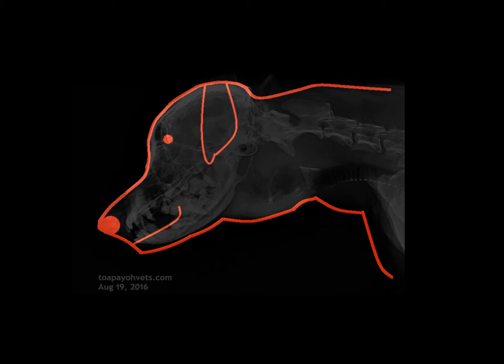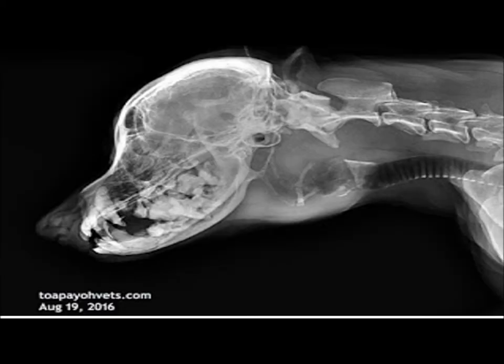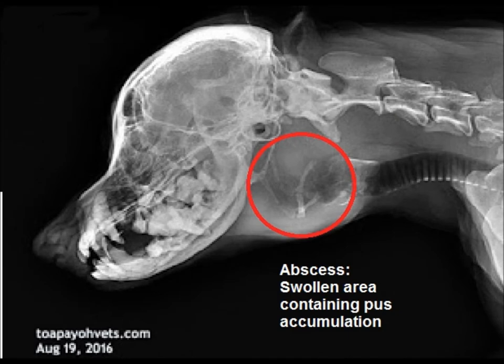An X-ray was taken of the mini schnauzer, and it shows us that the esophagus, barely visible, is constricted, and this could explain its inability to eat, while the trachea has also been pushed down, which causes its panting and difficulty in breathing. The parts around the neck which are cloudy is the abscess, which is a swollen area containing pus accumulation, and this inflammation is not in the trachea but rather around the muscles in the neck, and is likely to have caused the complications involved in this case.